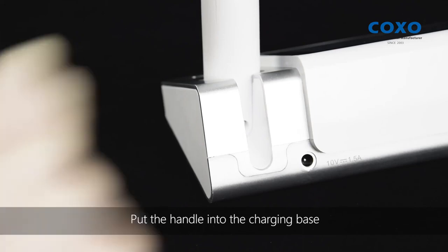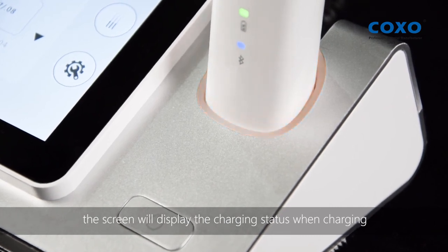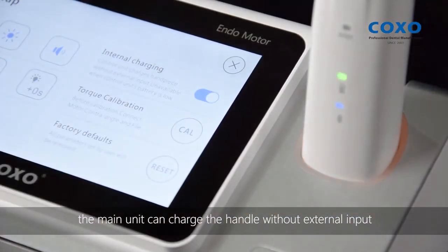Put the handle into the charging base and connect the adapter to charge the host and handle; the screen will display the charging status when charging. After turning on the internal wireless charging function of the main unit, the main unit can charge the handle without external input.